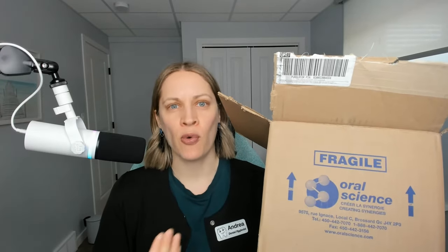Who wants to see an unboxing video from Oral Science? I'm a dental hygienist and I love this company. This is where I do a lot of my orders from, and I'm going to show you guys what I got.